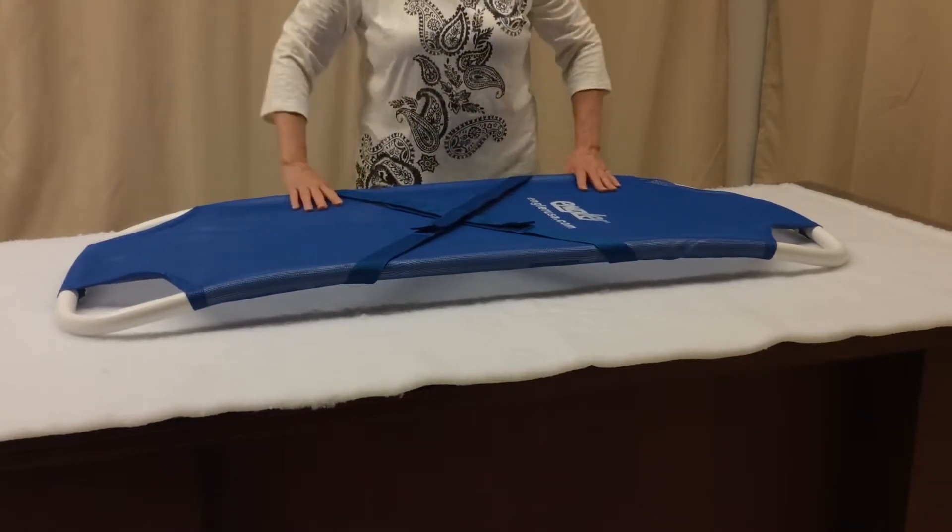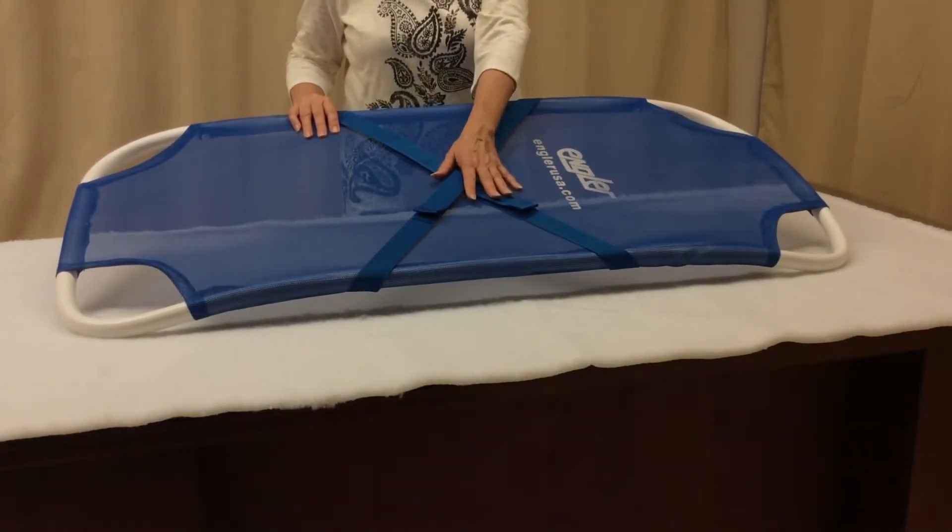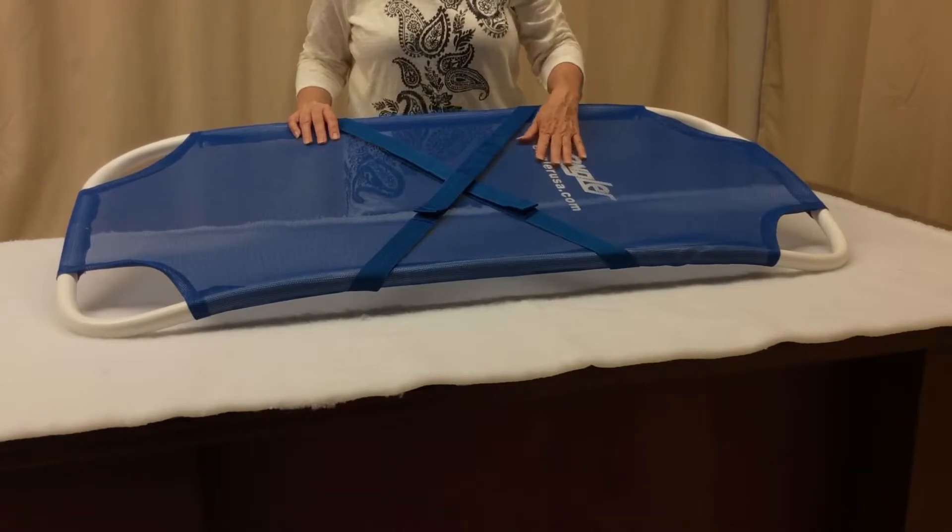Because it is also radiolucent, you can easily x-ray your patient while on the stretcher, and you can even perform surgeries and dentals.